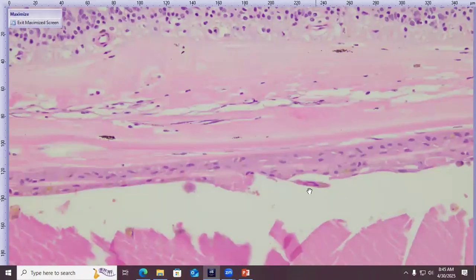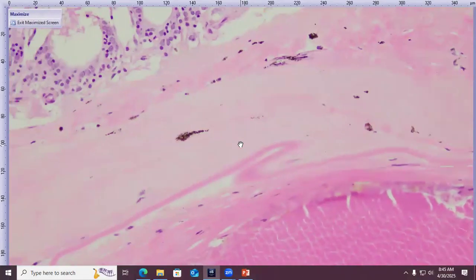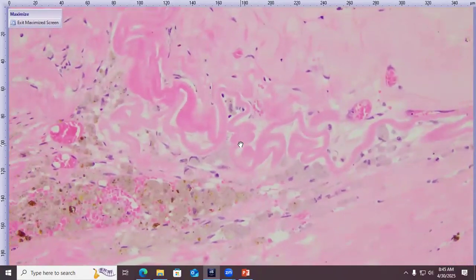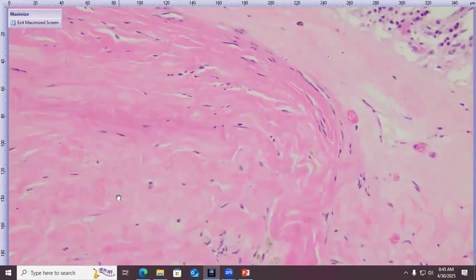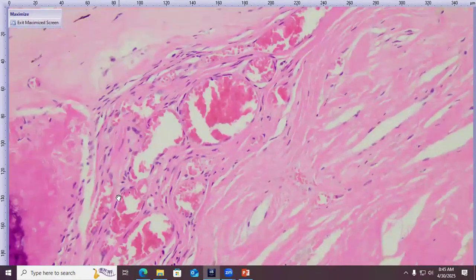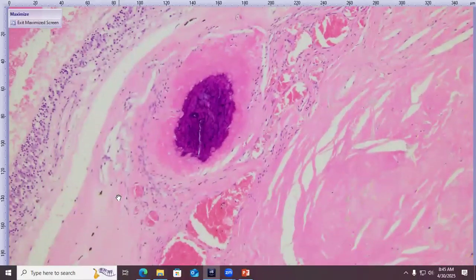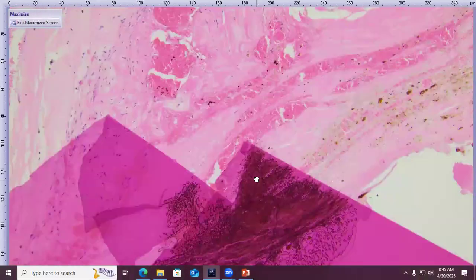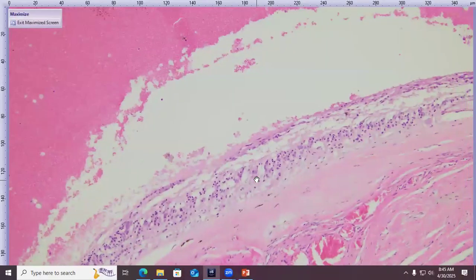And if we keep following our lens capsule here, posterior lens capsule, it gets kind of wrinkled, and it gets very serpentine. Again, more macrophages, and then it kind of blends with this collagenous plaque here that is filled with blood vessels. Here they are. And a little bit of osseous metaplasia here. And we've got all that blending here in the back of the lens capsule, intraocular hemorrhage. So this is pretty suggestive of persistent fetal vasculature.